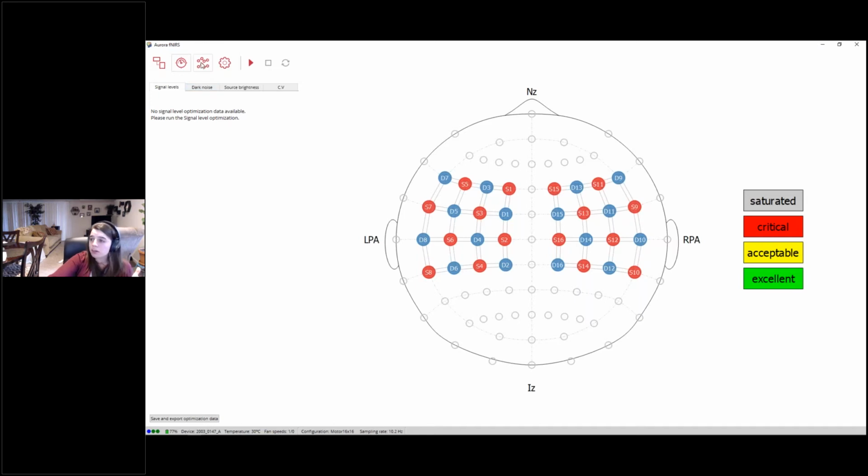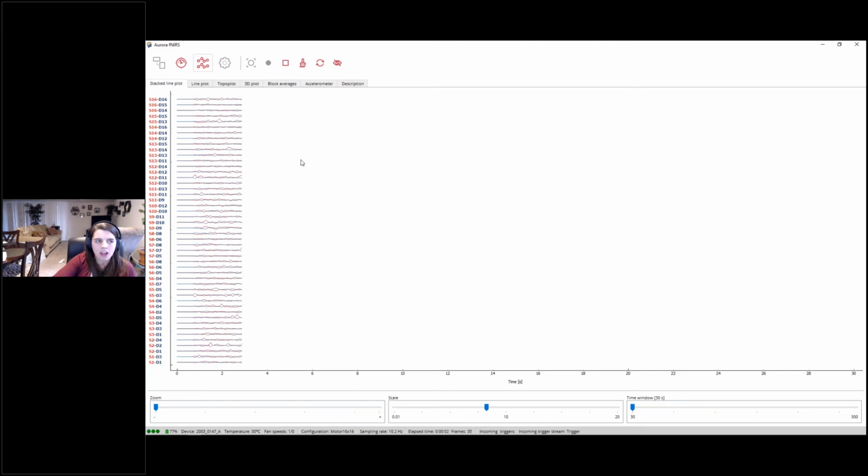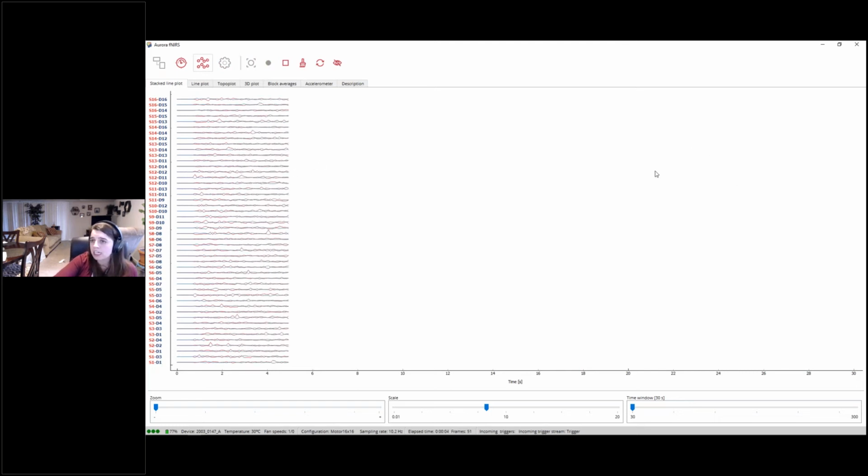Okay, I'm going to skip calibration. Right now, my device doesn't have any probes in it, so I'm just going to be collecting electrical noise. And I'm going to skip to the recording section. Click yes, click start. Okay, so here we have the data streaming.